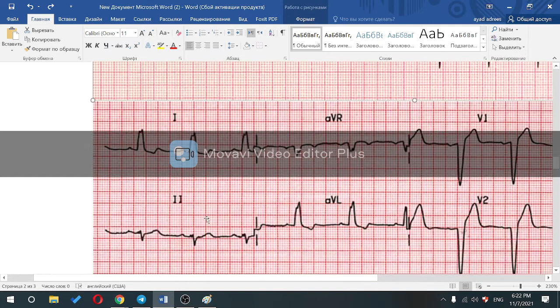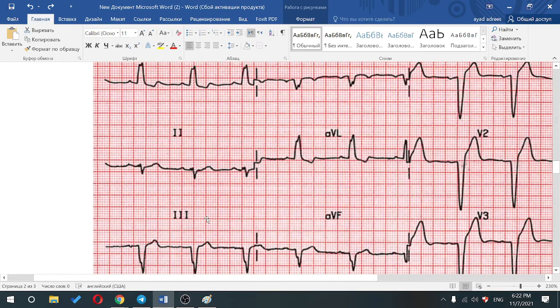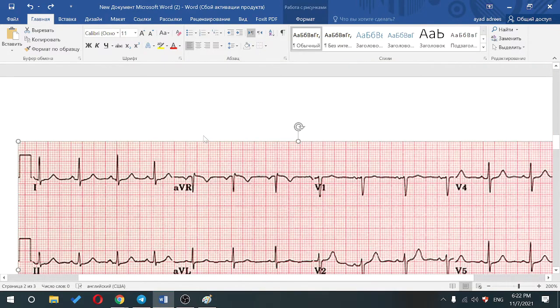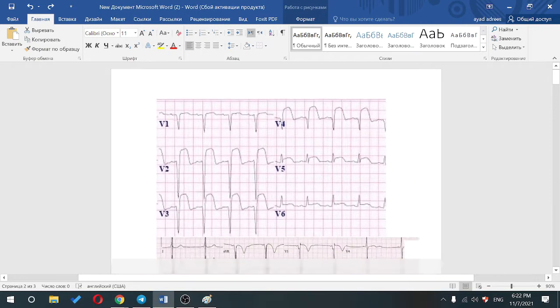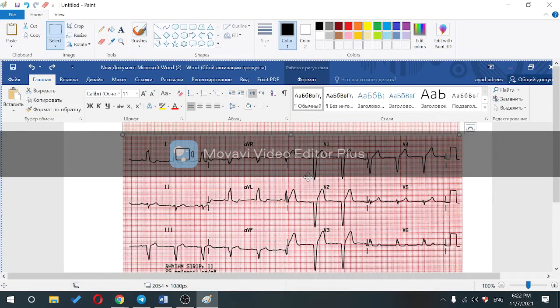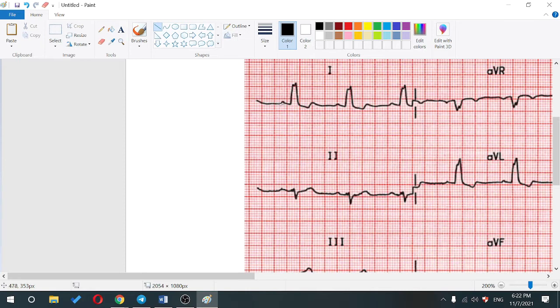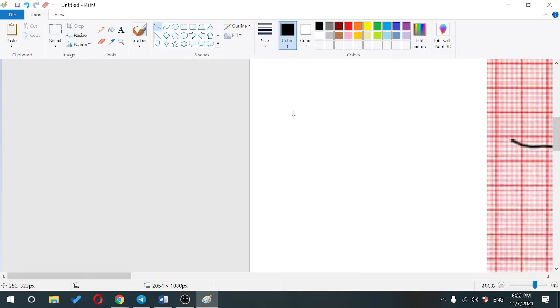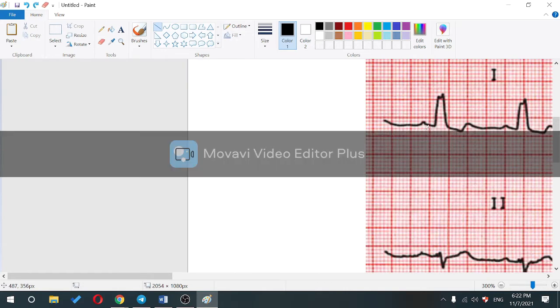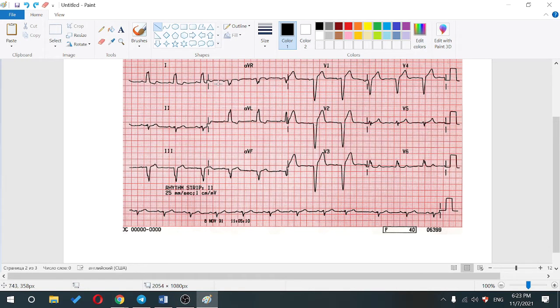Okay, excellent. Well, after checking the P wave, what do I check? Okay, there is a wide QRS complex, excellent. After the QRS complex, what do I do? Just a second, this thing keeps going around. Okay, yeah, that's better. You check the PR interval. The PR interval here looks kind of normal. Let's see, oh yeah, it might be five boxes. It's not ridiculously enlarged. Let's see, 1, 2, 3, 4.5. Mildly prolonged, but it's not the main pathology. But we cannot say it's prolonged until it is more than five small boxes. Okay, after the PR interval, what do we check?